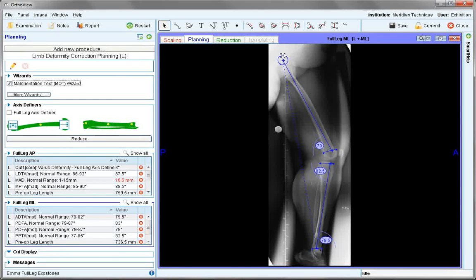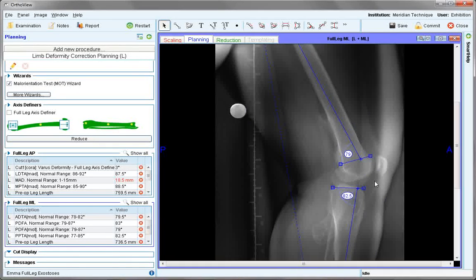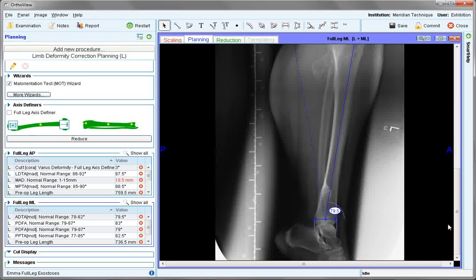The femoral head is centred, positioned with the axis line a third of the way across the condyles, and across the tibial plateau with this line being approximately one fifth of the way across the plateau, allowing for assessment of the anatomical axis. The ankle is also identified.